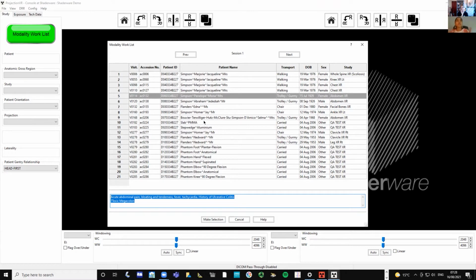Third level, that's fine. We can just pick a few cases for this. But for the fourth level, that's why I'm asking if we can add some more, because in case we will be getting this software, there is a specific regulation for the number of procedures for the clinical education, like how many upper, lower extremities, abdomen. So we might look into that one.